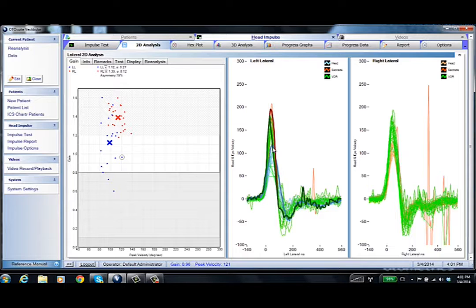And again, when you read the document that goes along with this, you're going to see all the reasons that can cause the goggle to slip. So if you see customers whose data looks like this, you're going to want to go through that whole list of things with them. But what's happening is, let's go through, let's find one of these. It's very obvious. Here we go.